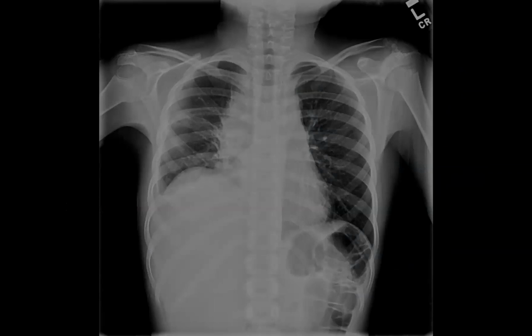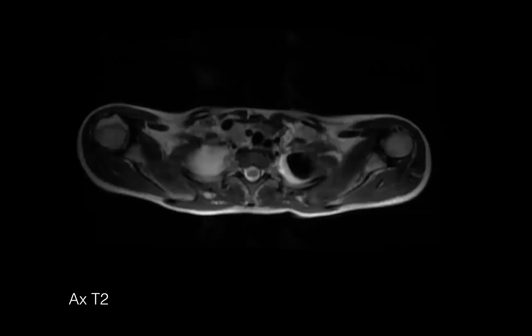Right, so just standard projection radiography. Very old school. But here you can also see that it's not exactly clear where anything is, although that diaphragm is elevated. This lung is edematous here. There's a pleural effusion. So now here's the MR.